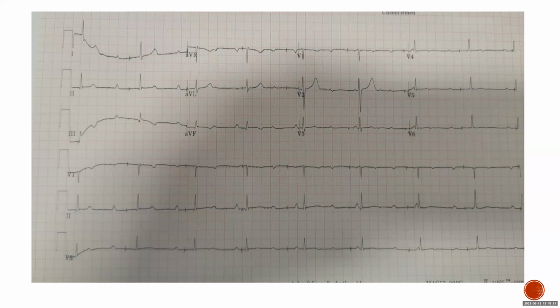Okay, so we have failure to sense atrium, pacing but not capturing, under sensing. Okay, let's go through the steps we talked about. So is it capturing? Yes or no?